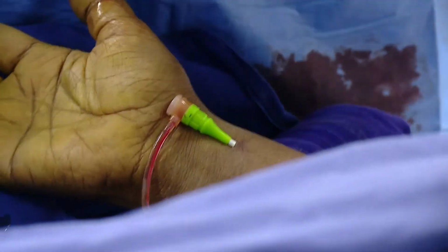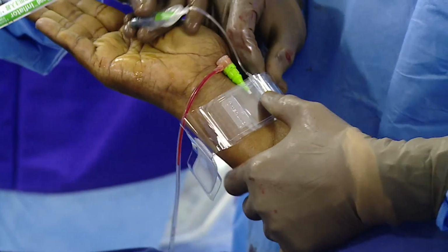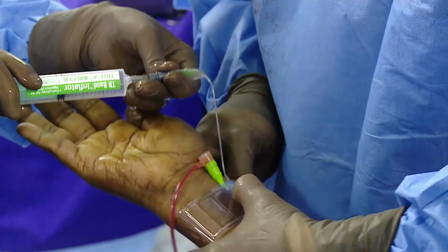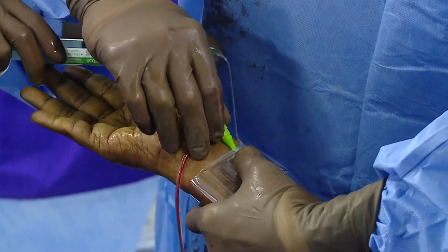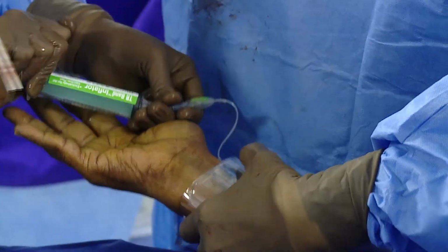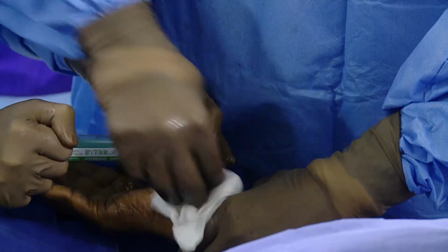I'll show you. This is the TR band we routinely put for the transradial cases, particularly because we don't want to lose the radial artery.